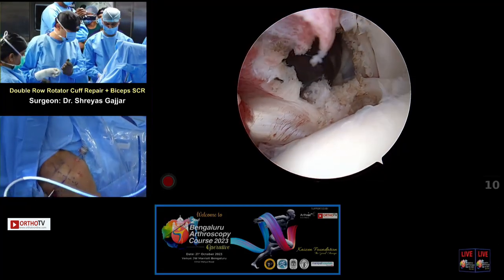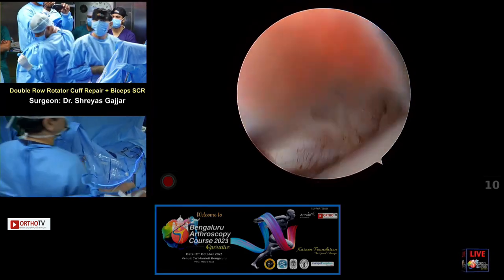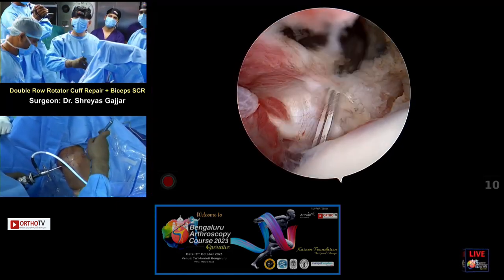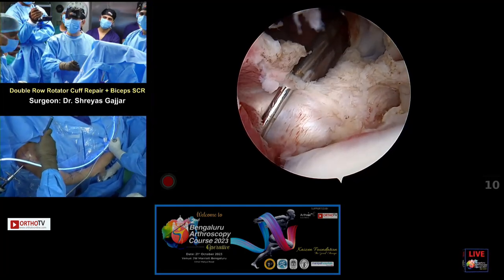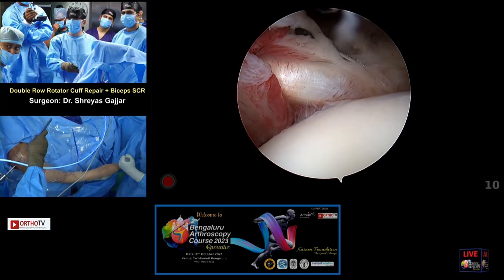Okay, so we'll now just show you the repair part. Outside image. So, you know, we've got this repair. We have kind of covered that tone part. Now we're going to externally rotate, if you have the outside image, to ensure that we have not over constrained the external rotation.